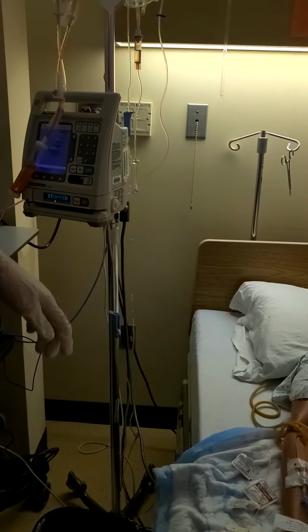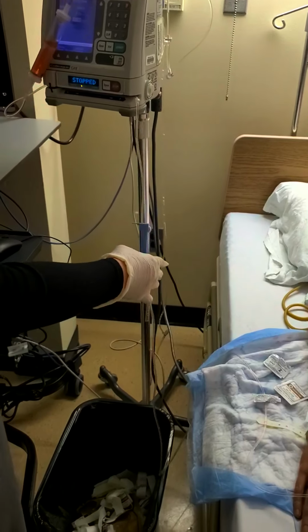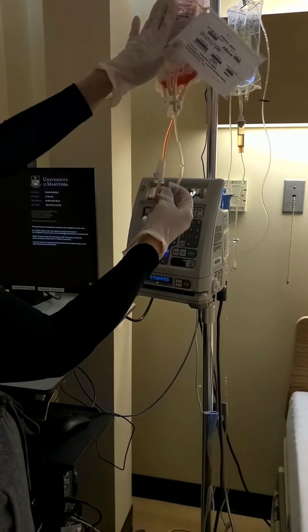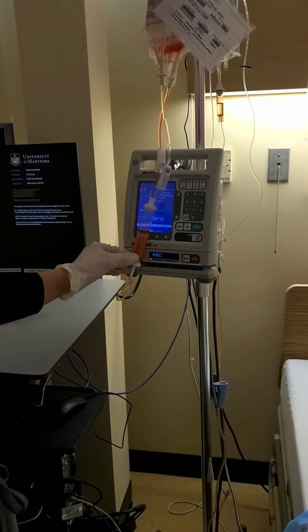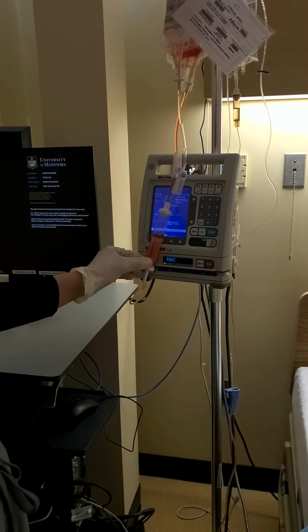So the patient is now connected. We're gonna check for clamps. And this is clamps, so we're gonna unclamp it. We also want to take a look at these clamps. And for the normal saline, we should clamp that one, and for the blood, we're gonna leave that unclamped. And we can start the infusion. So it's going for 50 mils per hour. We're gonna take a look for 3 drops here, okay? So that's 1, 2. And 3 drops. Perfect.